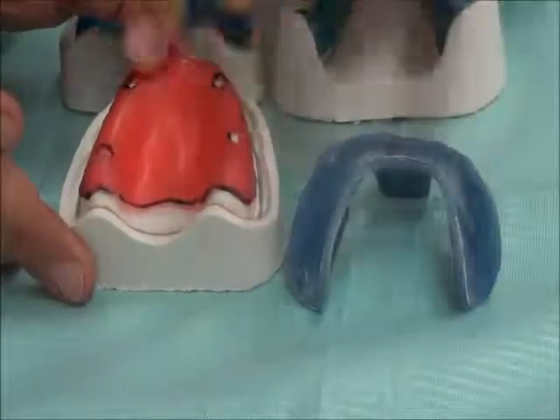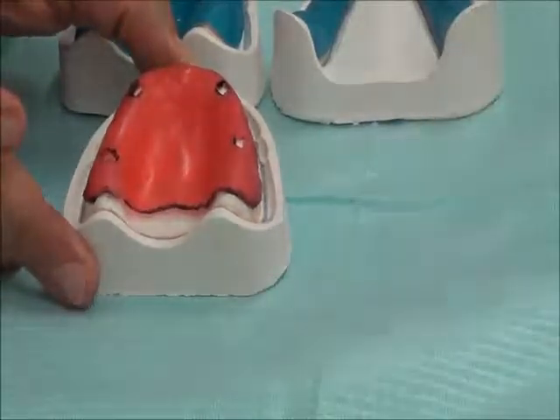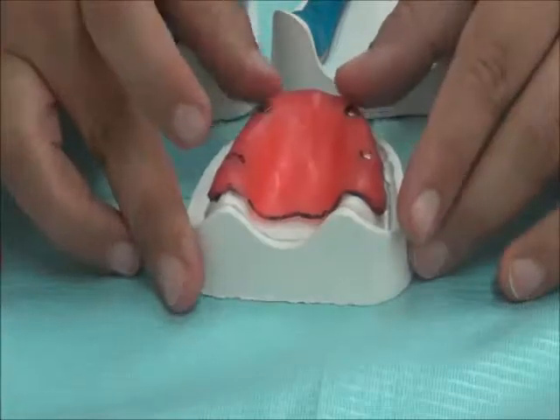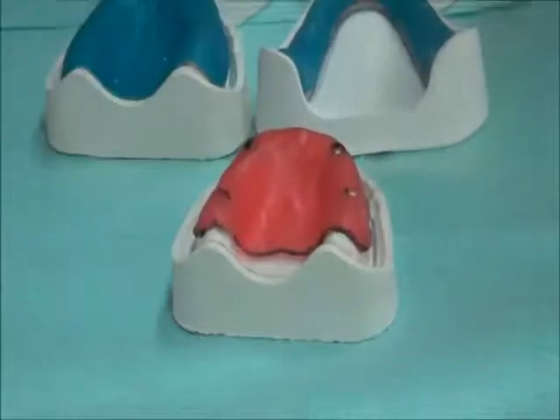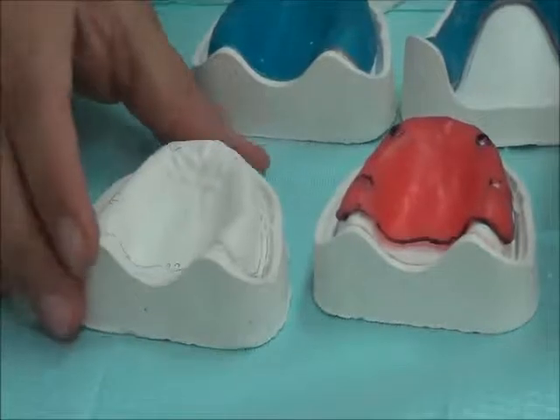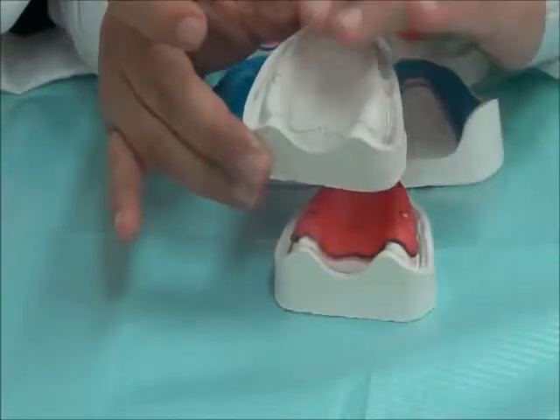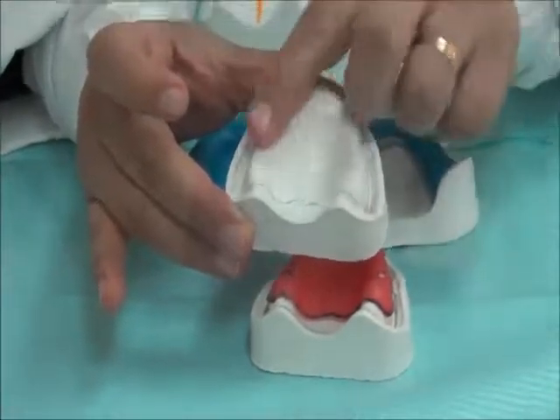But in the cases where we take an impression with a full relief, we will have that the denture, while functioning, will be put on the tissue while in resting position. So all of the areas covered in wax, once we take out the wax and begin the impression procedure, these areas will all be taken as static. Nothing is compressed or recorded in a compressed status. Once we place the fabricated denture over resting tissue, the denture as a solid material and under occlusal function will not stay solid, and it will not stay in its place.